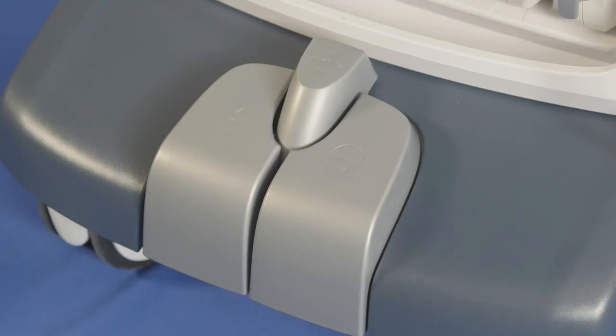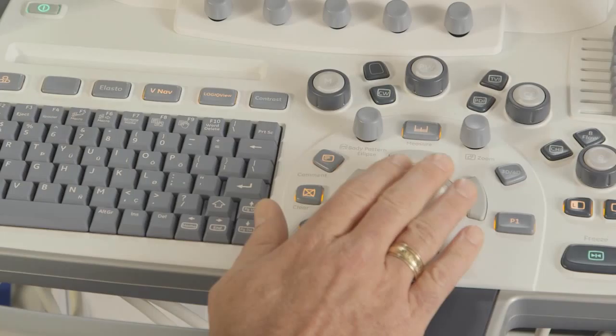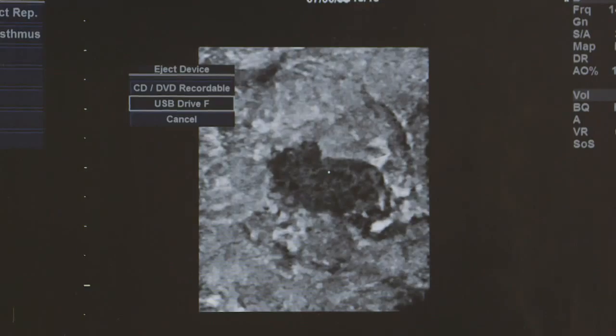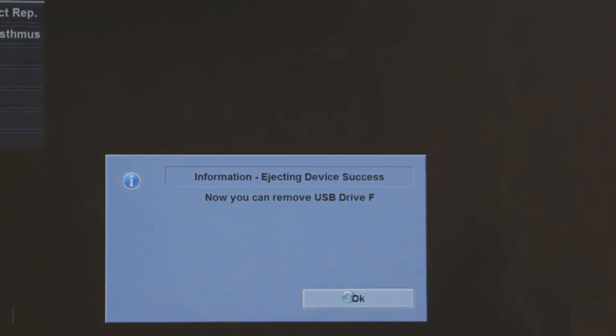If this switch is turned to the on position when the power cord is plugged in, the power key located on the console will light up amber and turn green when activated. If the amber light is not seen, check the circuit breaker switch located at the back of the system.